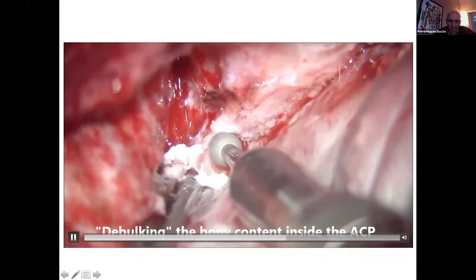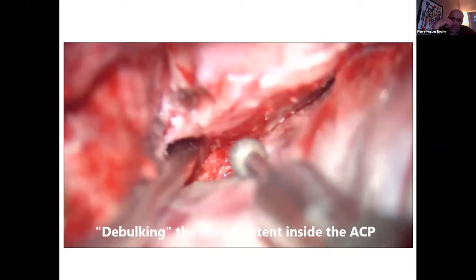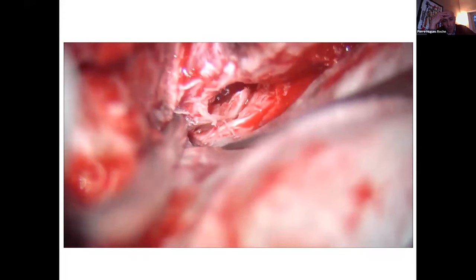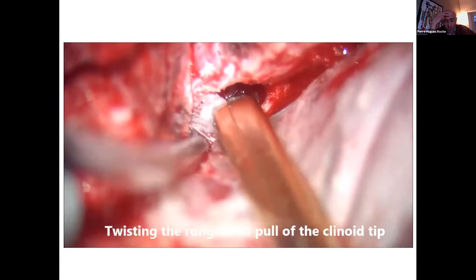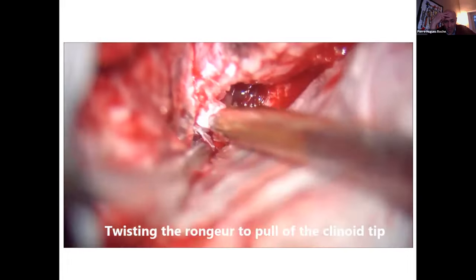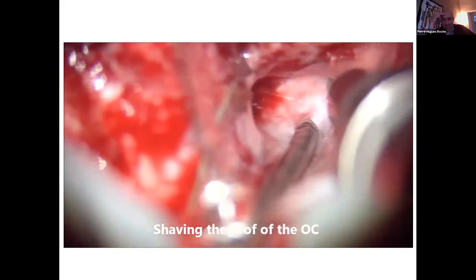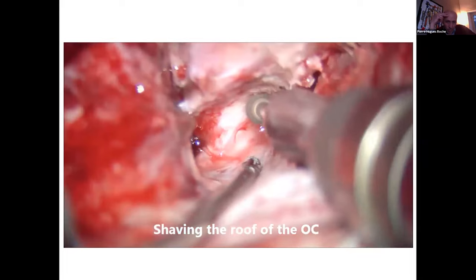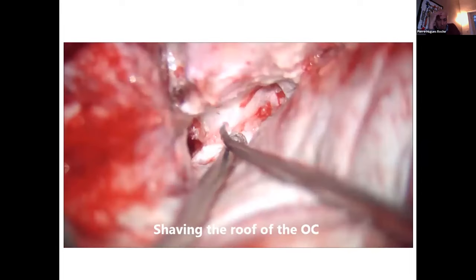Then we call that the eggshell technique because we dig inside the ACP under irrigation with a three millimeter diamond drill, and you crack the contour of the ACP. Please pay attention not to mobilize the bone, the shark tooth at the level of the optic canal. Be away from the optic canal. Then we will drill the optic roof and we will drill the optic strut to skeletonize 270 degrees of the optic canal.